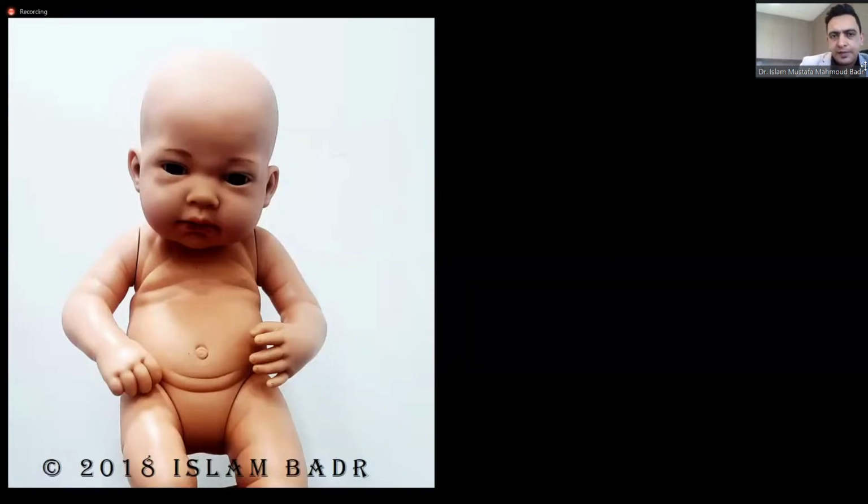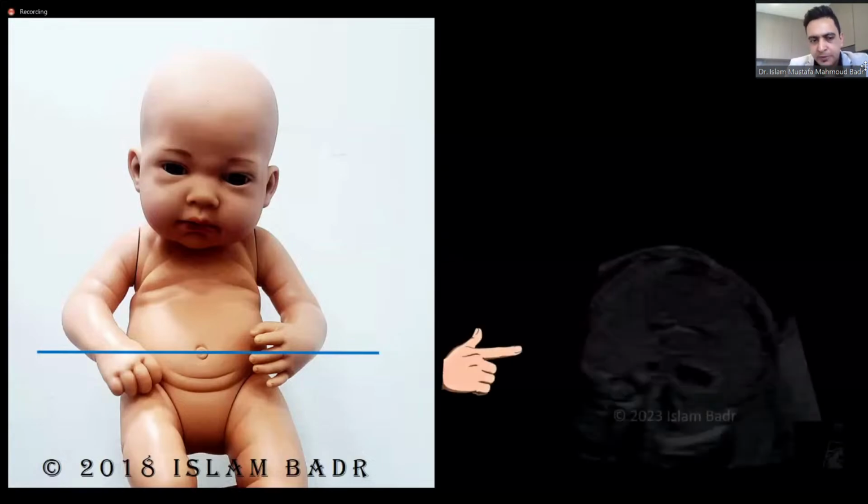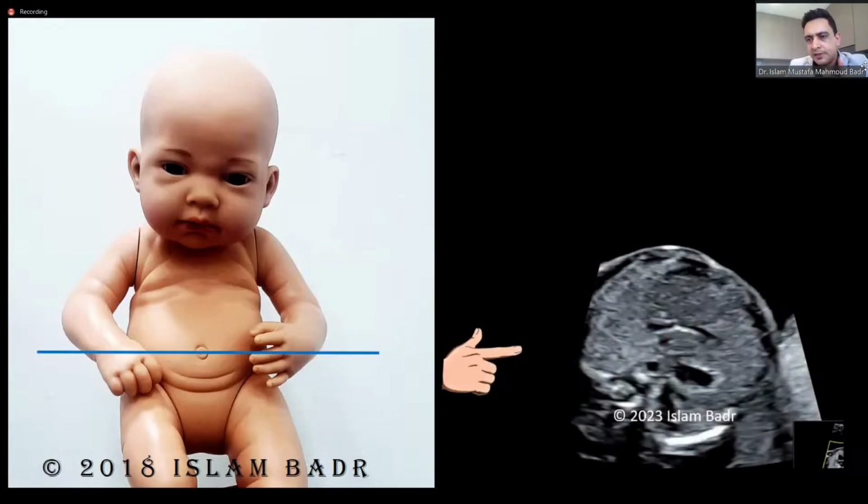Okay, let's have some ideas about examination of the fetal heart. Of course, this is a very short webinar in which I don't have enough time to elaborate on examination of the normal heart. But I just want to give you some small hints about examination of the fetal heart. If someone in the attendees has never seen something like this, we start with the abdomen, getting the plane of the abdomen. It's not necessary to get the ideal plane for the abdominal circumference.